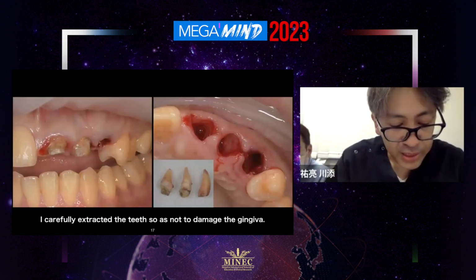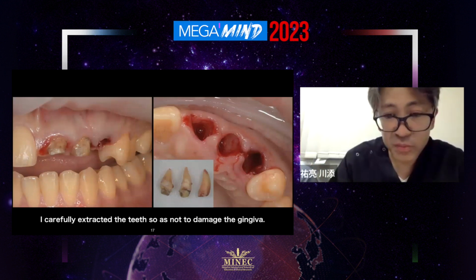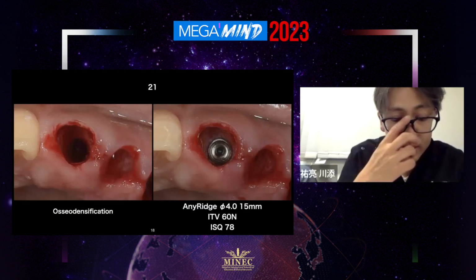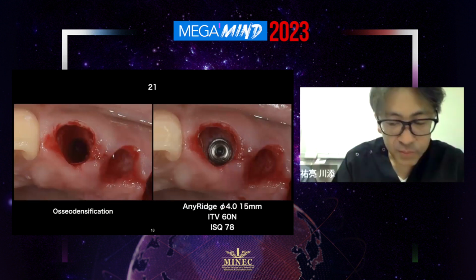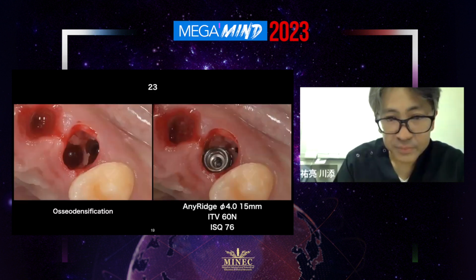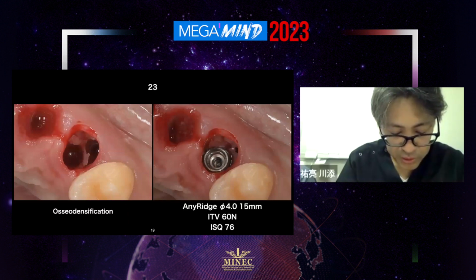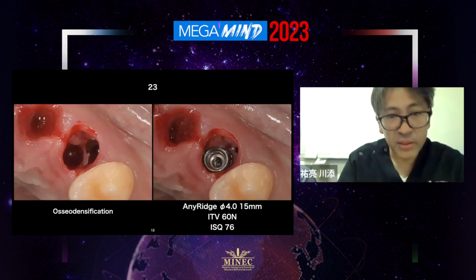First, I carefully extracted the teeth so as not to damage the gingiva. Next, I prepared the implant site. The bone quality was poor, so I improved the bone quality using the osseodensification technique. The result was good primary stability. Tooth 23 was also treated using the same protocol, resulting in good primary stability.